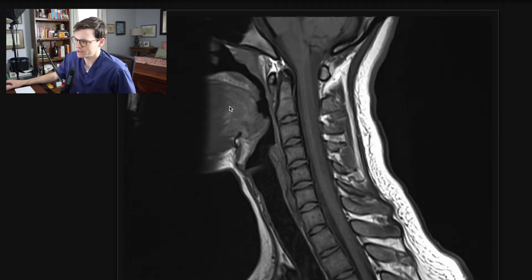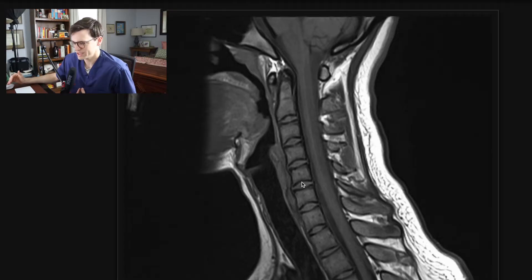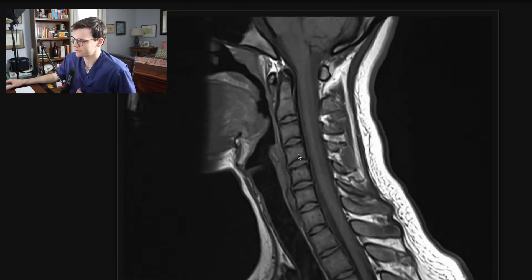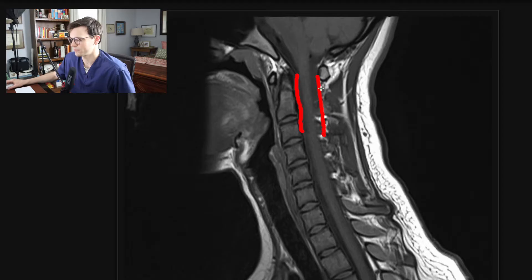After looking at the alignment, I take a quick look at the disc space heights. I just make note of whether there's been significant disc height loss, which is commonly seen as we get older and have degeneration of the actual discs. In this case, these are relatively normal disc spaces. I then pay attention to the spinal canal — I look at the spinal canal in every sequence. The spinal canal runs here, which is what I'm partially outlining.